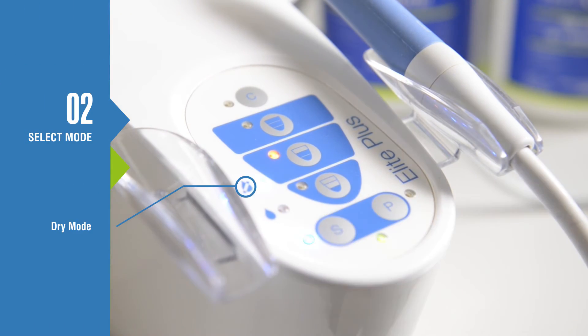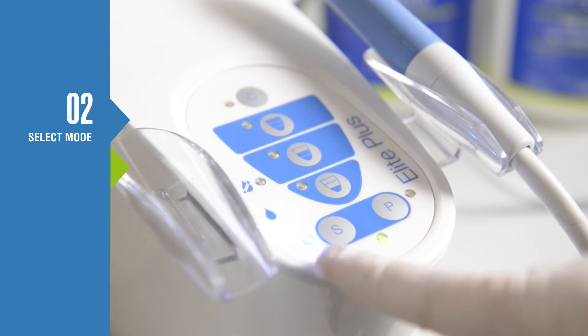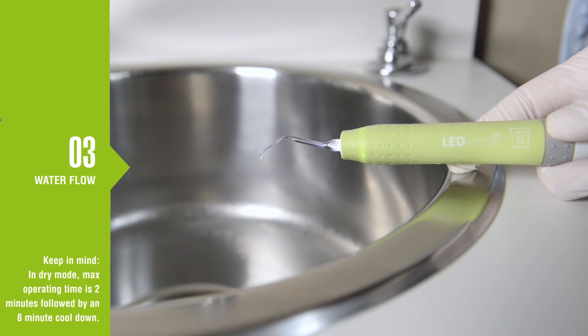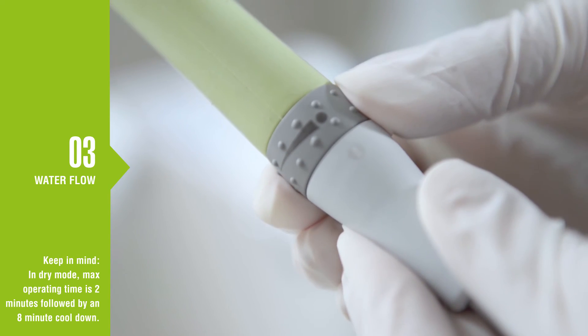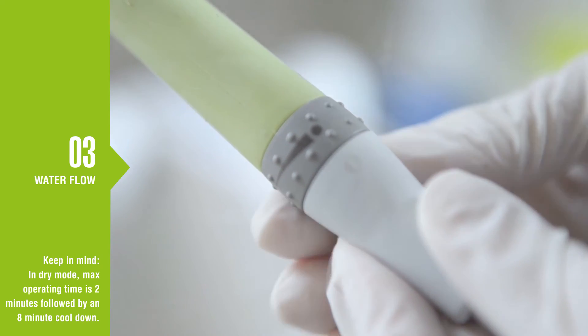Pressing S will toggle the dry mode, irrigation mode, and back to normal scaling mode. If there is no water coming from the scaler, check to see that you have the irrigation mode turned on. With the scaler handpiece over the sink, press the foot control pedal and adjust the water flow using the valve on the handpiece. The dot on the connector indicates max water flow.